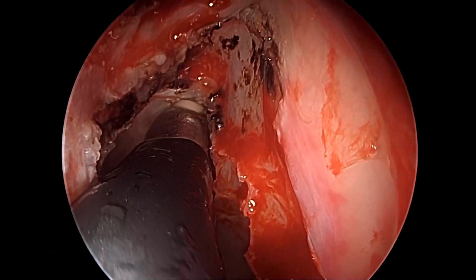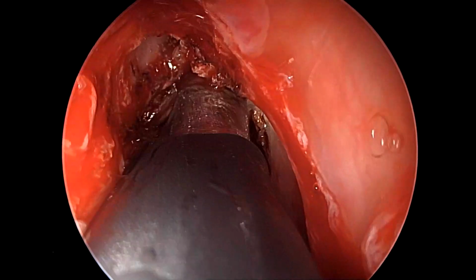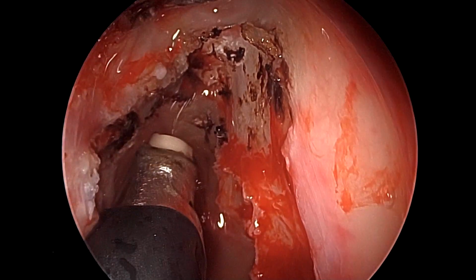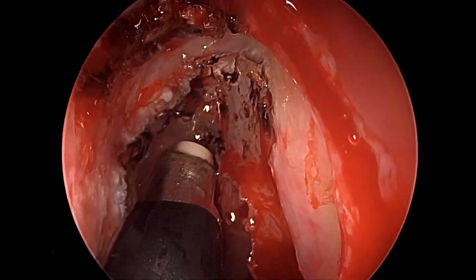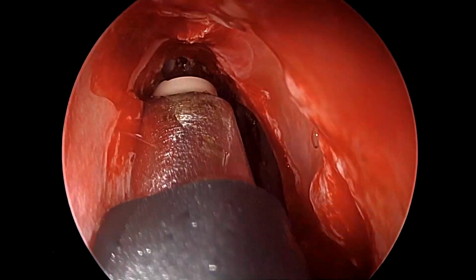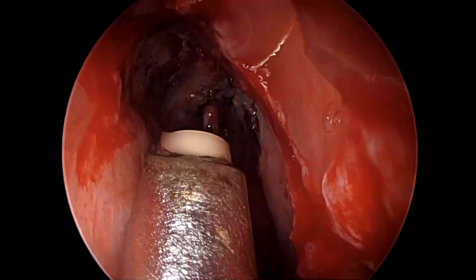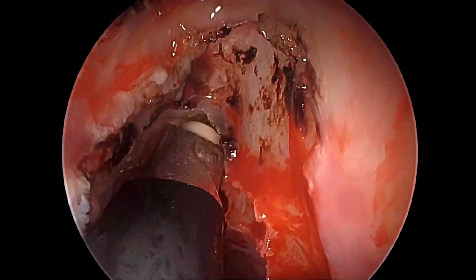So we see here we are again ablating, and possibly the ethmoidal vessels also, coagulating them and ablating them turn by turn so that we do not miss any vessels here, and the entire base of skull around the defect is made bare.